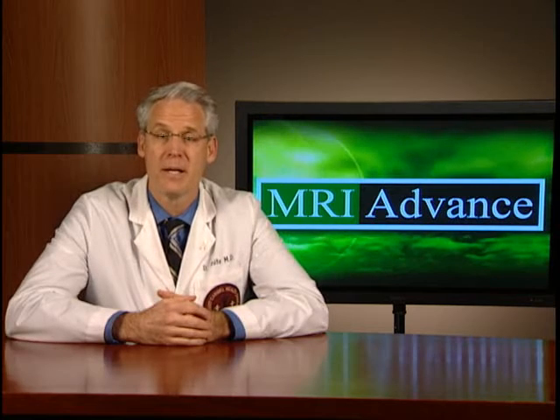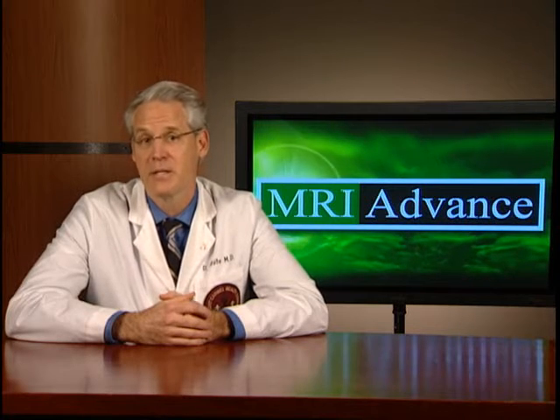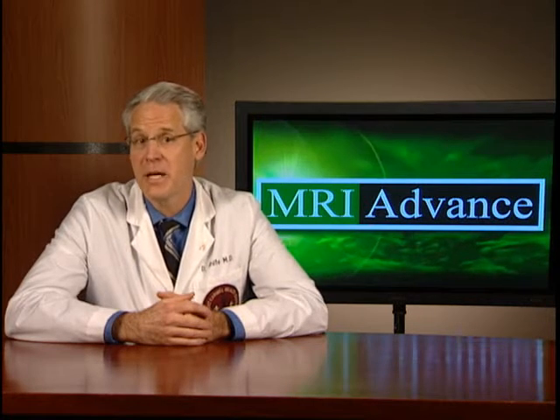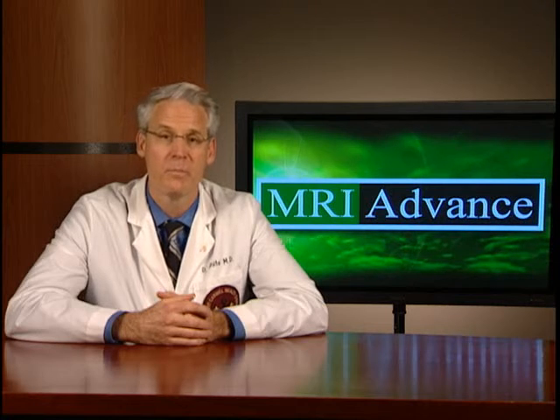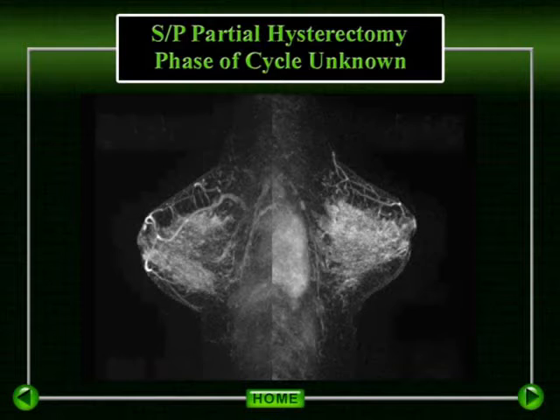For this reason, we found it beneficial to have our central scheduling department contact our breast MRI technologists at the time of scheduling an exam. In this way, our technologists are able to assure that the appropriate screening questions are addressed, such as the phase of the menstrual cycle, is the patient postmenopausal or on hormone replacement therapy, as well as what are the indications for breast MRI. They have become very familiar with the indications for breast MRI, as well as appropriate timing for scheduling and also with the exceptions that arise to our standardized rules.